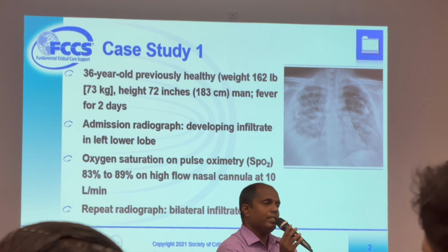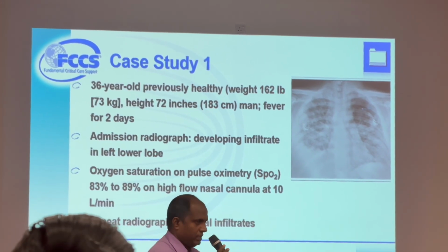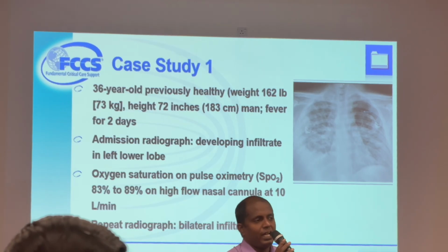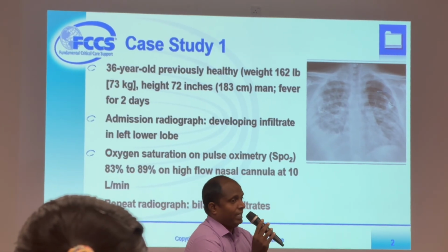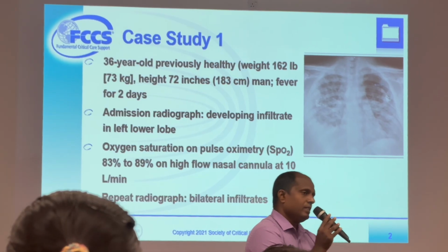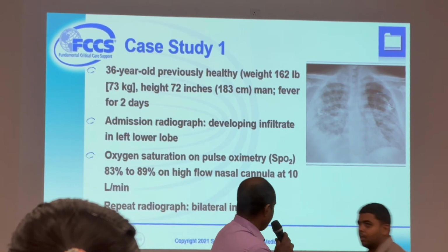Then always try to keep plateau pressure or peak pressure less than 30. Meantime, I need to check that the alarms are set correctly. I will check the saturation and regularly do the ABG and change the setting accordingly. So ARDS done.